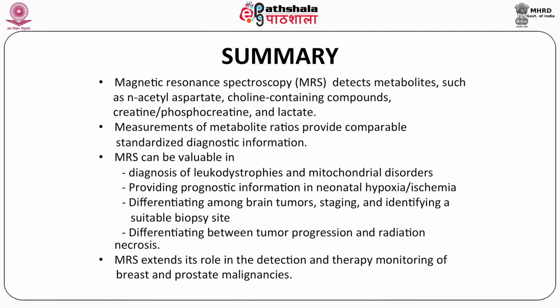MRS extends its role in detection and therapy monitoring of breast and prostatic malignancies, and we also discussed its role in liver malignancies where phosphorus MRS is coming up in a big way to assess focal liver lesions.